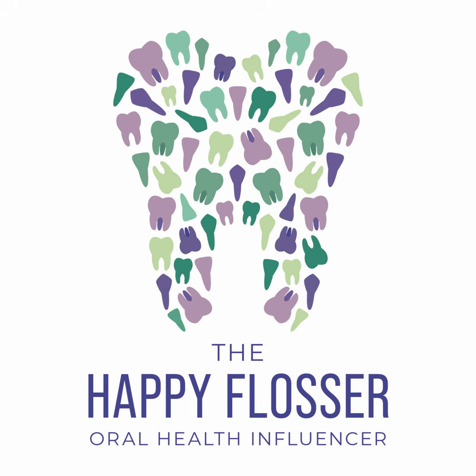This will help develop rapport with your patient. It's a little easier for your patient to have those radiographs done. It settles your patient down a little bit and relaxes them so that they are a little more calm throughout the process for when you get to those more challenging images in the posterior region.